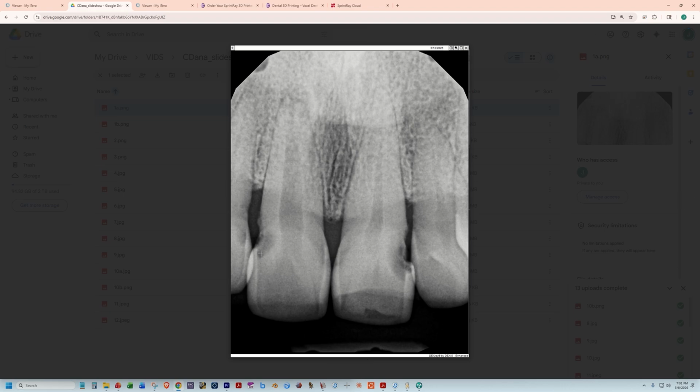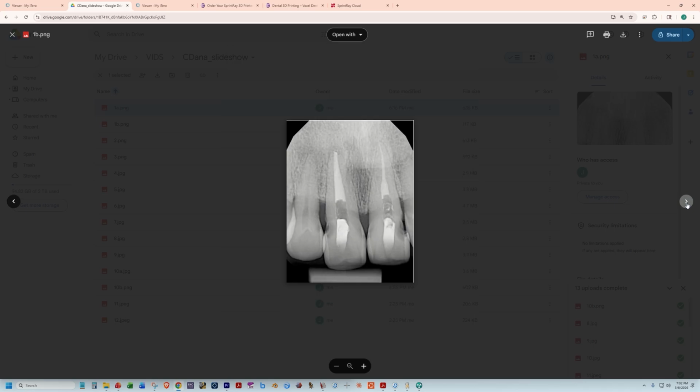Originally, okay, so here's the story. Originally, I treatment planned these for root canal, build up, crown, etc. So when I saw her at the first appointment, we took these radiographs and I looked in her mouth and I thought, oh, okay, I will send her to the endodontist. She can get root canals on these two teeth, and then she can come back and we can restore them after cleaning out the decay, that type of treatment plan. So I sent her to the endodontist. She had the treatment done.